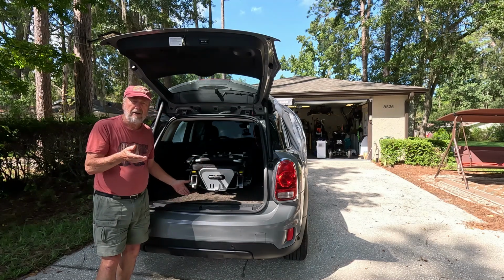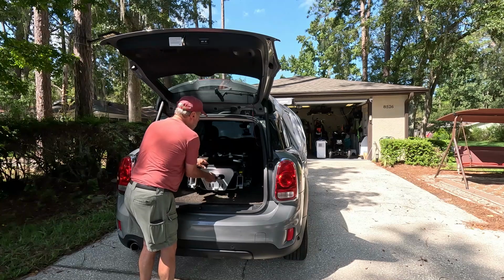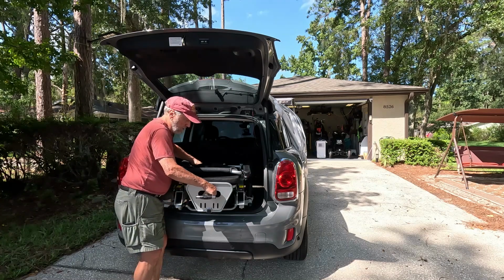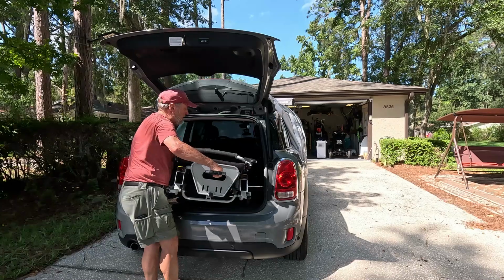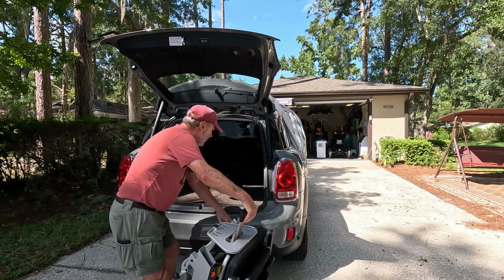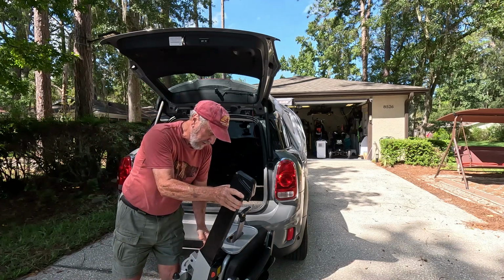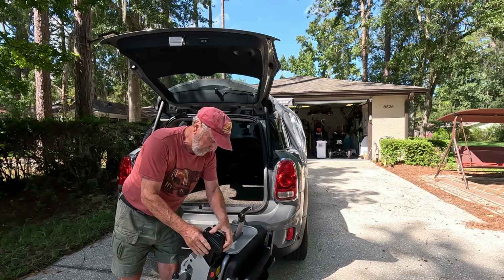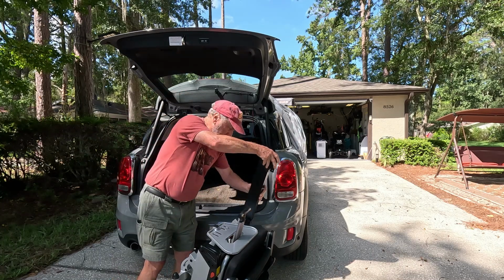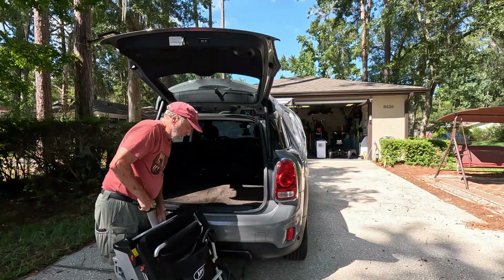And then to get it out, I fold it back up into this position, and then just pull her out back the way I did it. And I just picked it up like this, and it's not that heavy. Then I can put the batteries back in. This one went in this side. This one in this side. And I can take it back into the garage. Okay, let's do that. Look how easy.